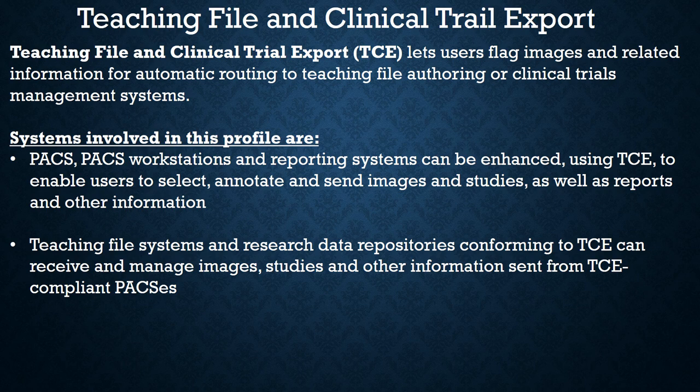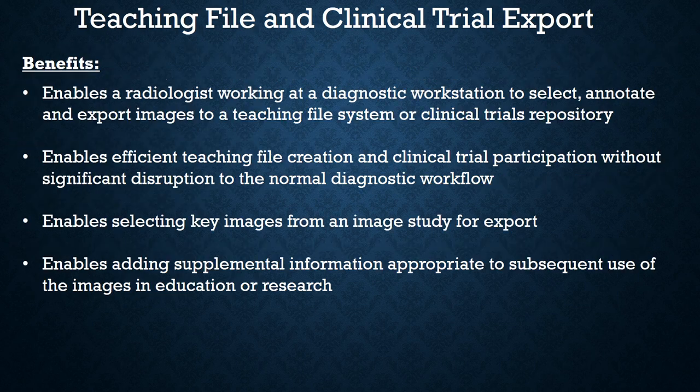In order to accomplish these tasks efficiently, a user must be able to flag appropriate images and add supplemental information and anonymize imaging studies, particularly in research trials. So this profile helps users do that.